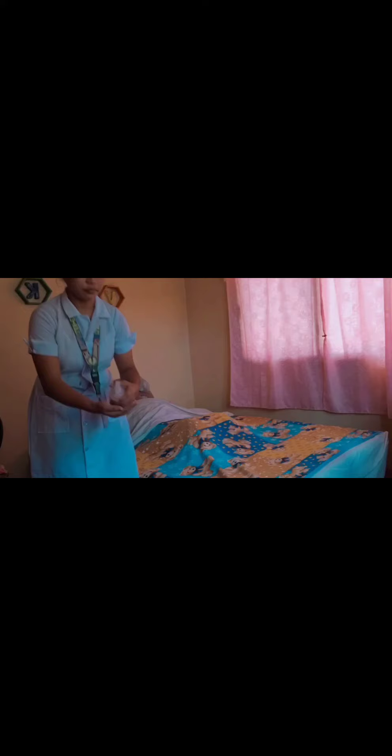After that, we need to document the data. After all the procedure, we need to document. The rationale of this is to document the linen change and the client's tolerance while being out of the bed.